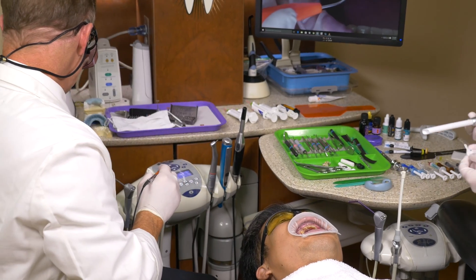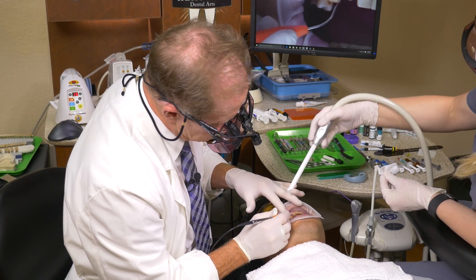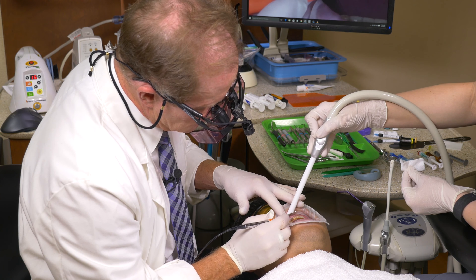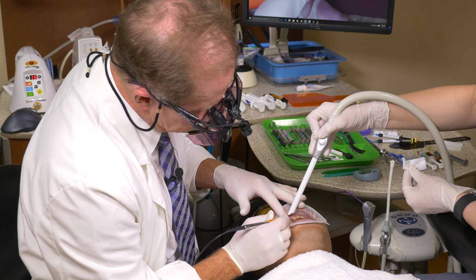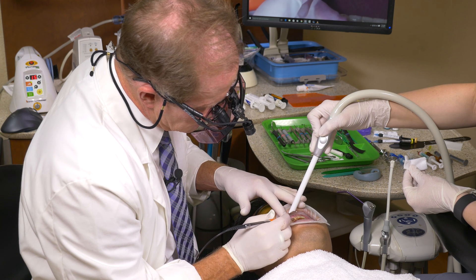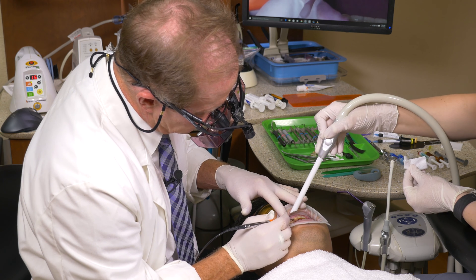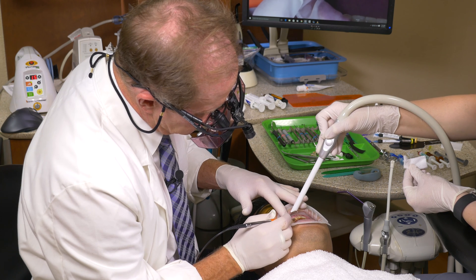I'm going to bump up the energy a little bit — 1.2 watts is not that high, so I'm going to go to 1.5 watts. Imagine you're creating a little socket that a little egg is going to fit into, with the apex of that egg being dead center on the ridge. Again, low energy, because the healing will be much quicker.